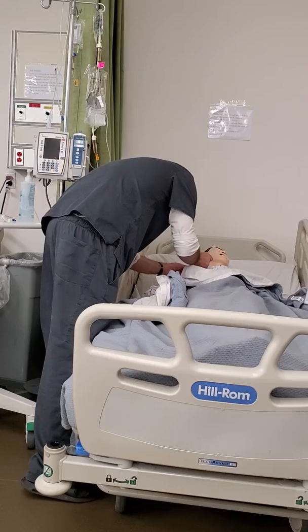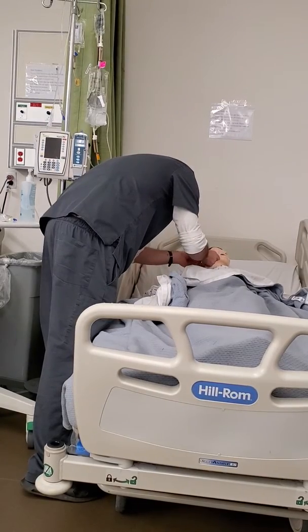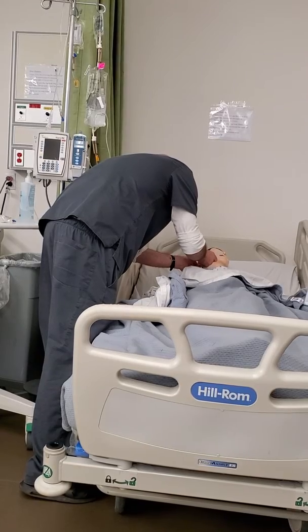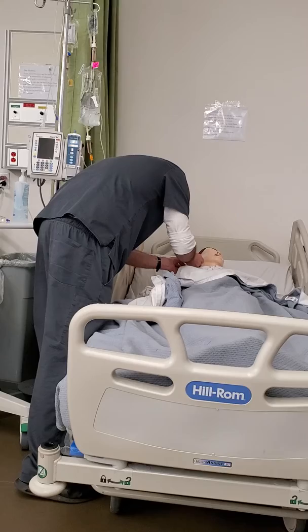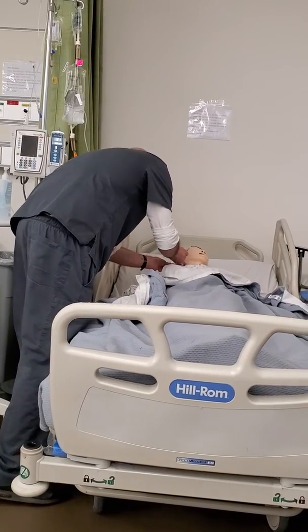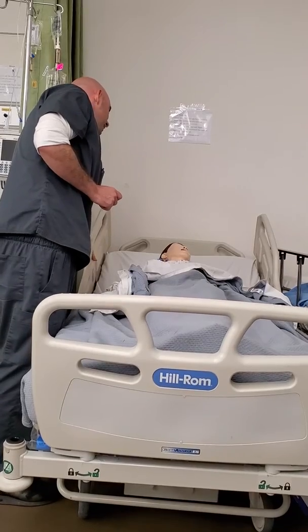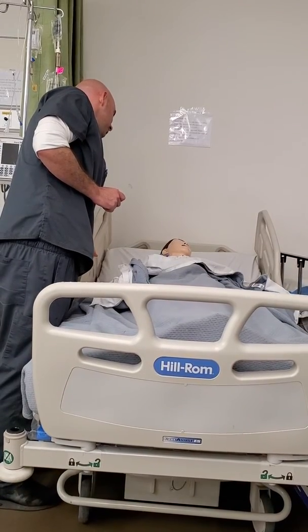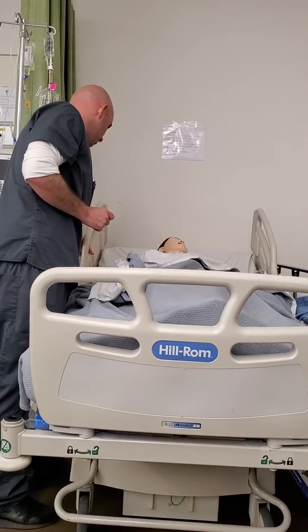Distal, proximal, this is medial. Medial is used for TPN, so I don't want to do that. So I'm gonna flush the proximal line. I'm gonna raise this so I can save my back, so I can work for 35 years and keep it at a nice safe level.